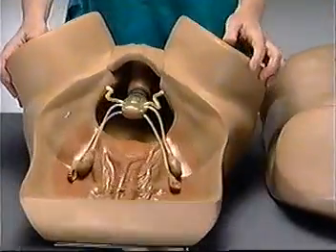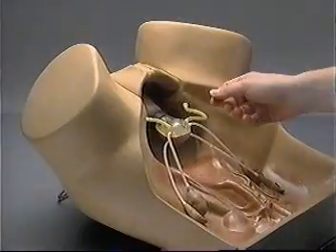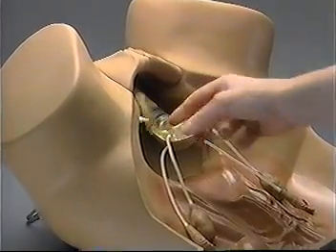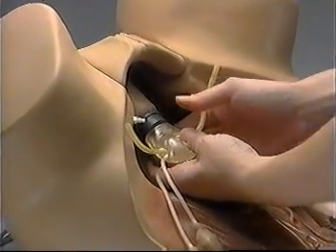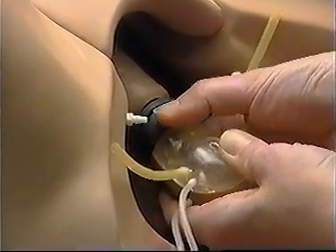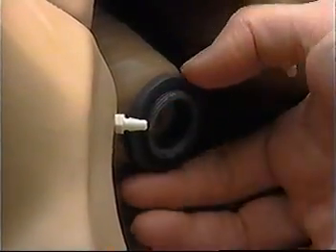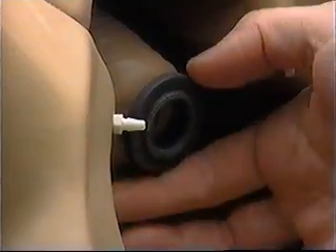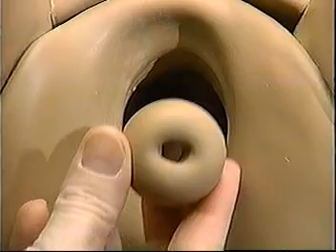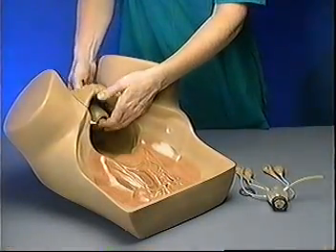If you wish to change the anteverted uterus and normal cervix which are shipped attached to ZOE, you must first remove the uterus. Start by pulling the round ligaments away from the wall. Then hold the uterus steady while turning the wide gray ring counterclockwise until the cervix and uterine body are separated. To remove the cervix, turn the thin gray ring counterclockwise until it comes off. You can then push the cervix out through the vagina. To reassemble, simply reverse this process.